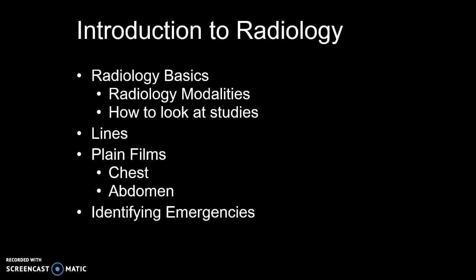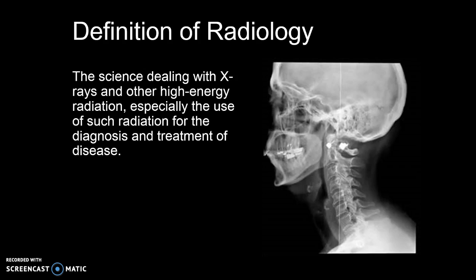Students often ask me for more information regarding radiology. However, please remember radiologists have gone 4 more years after medical school. You are not expected to know everything. Today we are going to go over radiology basics and discuss the information most important to nurse practitioners: how to verify lines, look at plain films, and identify emergencies.